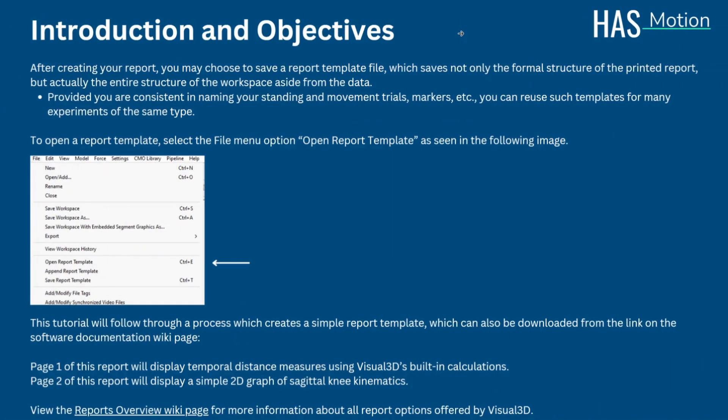After creating your report, you may choose to save a report template file which saves not only the formal structure of the printed report, but actually the entire structure of the workspace aside from the data. Provided you are consistent in the naming of your standing and movement trials, markers, etc., you can reuse such templates for many experiments of the same type. Examples of this application can refer to the same experimental protocol or multiple subjects from the same experiment.